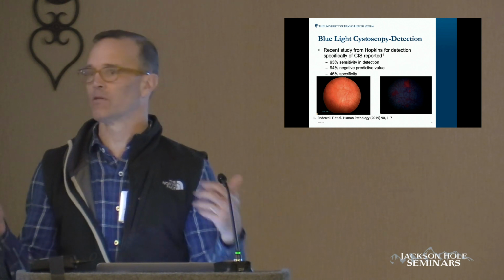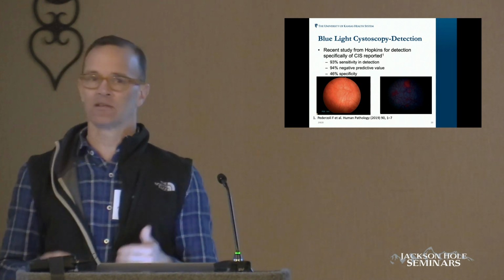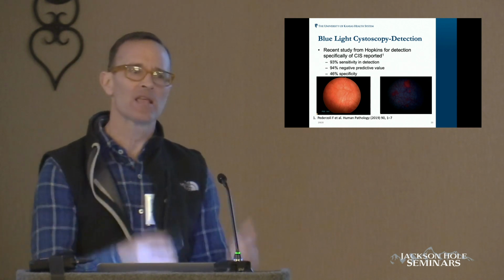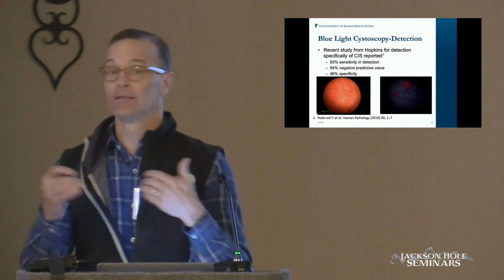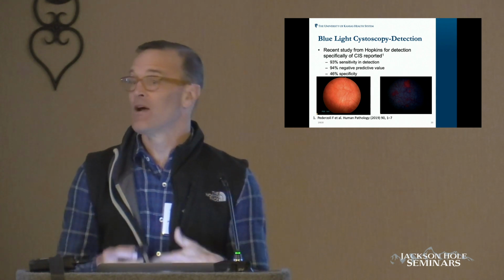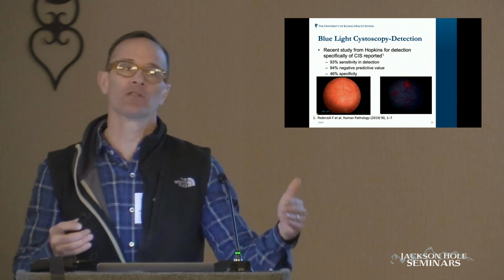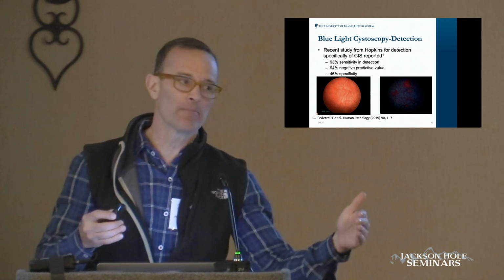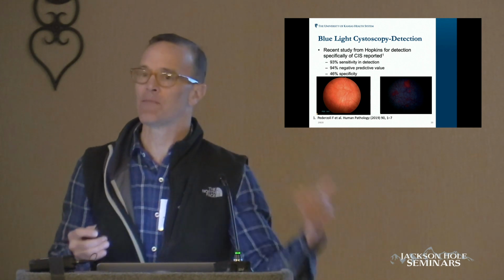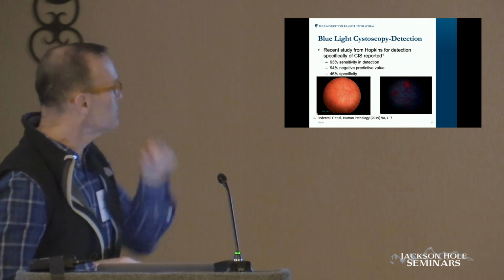I get a lot of patients sent to me with non-muscle invasive bladder cancer that's BCG refractory. They're either not very good candidates for cystectomy or they're highly motivated to keep their bladder. And what I say is, let's take you back, let's use blue light, let's resect all of the lesions. I may resect stuff that's not positive, but if I want to give that patient the best chance of responding to BCG or not having recurrence and keeping their bladder, I think I'm going to be aggressive with my resections.